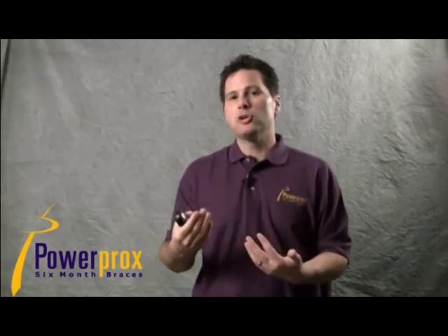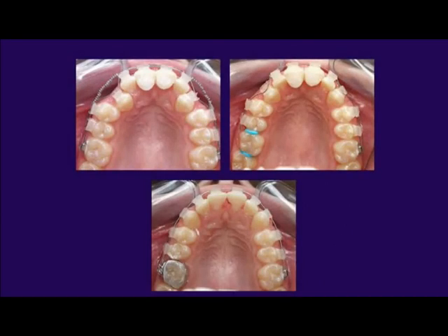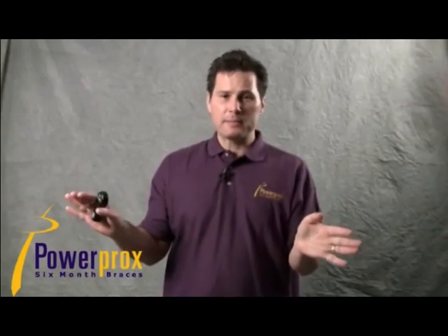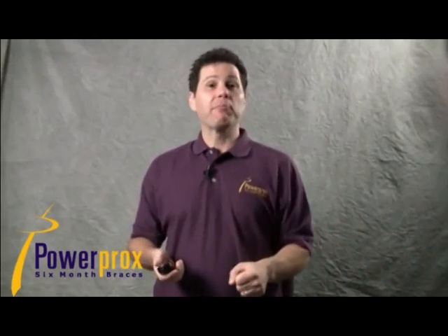Also, for canine cases I tend to prefer the alignment piggyback over the slingshot. In this double canine crossbite case, I'm using an alignment piggyback with an 018 NiTi or steel main wire and a 014 nickel titanium piggyback going to both canines. Within just a couple of visits those canines were brought into position. But the key: make space first, then put your buildups on the same day as your slingshot or alignment piggyback. Follow that one-two-three system and anterior crossbites will be absolutely no problem.